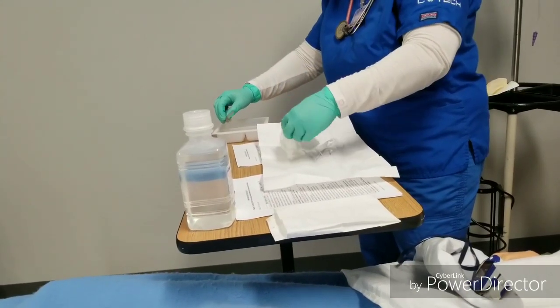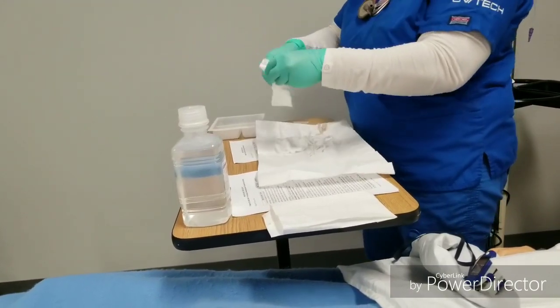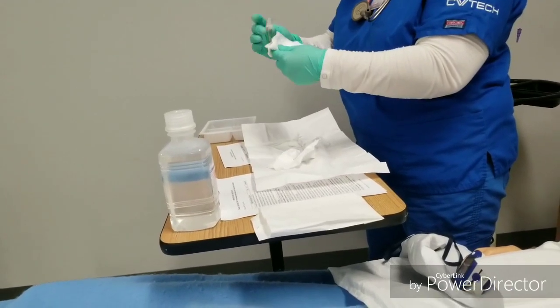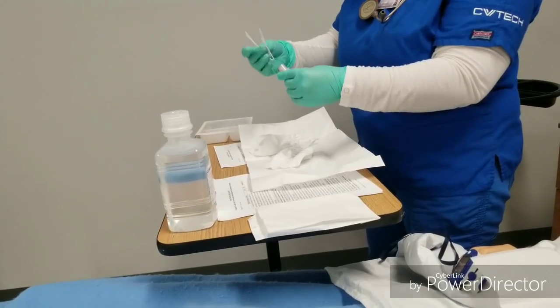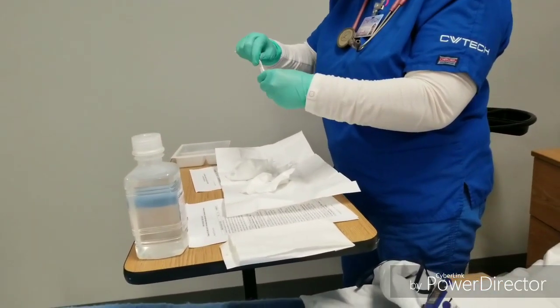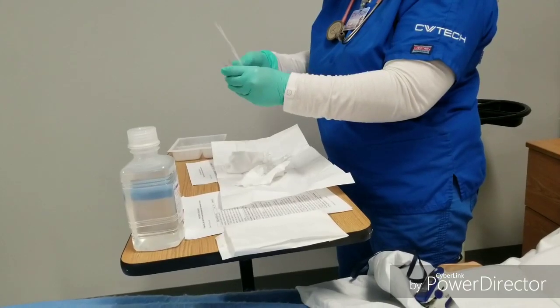Grab your gauze for drying. Dry. You're going to use these pipe cleaners to dry inside there. Generally 2 will fit, and you just pull them all the way through.